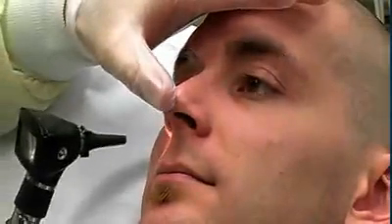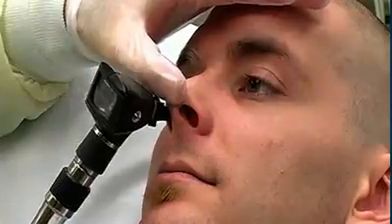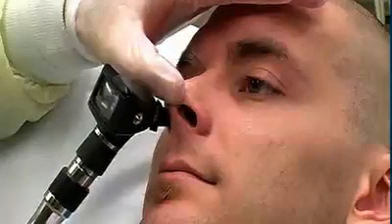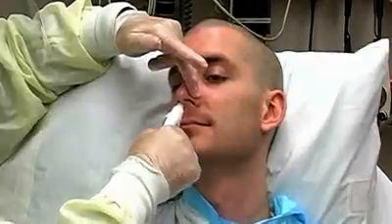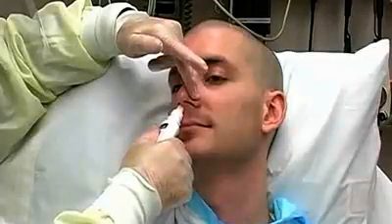Look in the nasal passages with an otoscope to identify septal deviation or other impediments to tube insertion. Use these observations to choose the appropriate side for tube insertion. Next, apply a topical vasoconstrictor such as oxymetazoline or phenylephrine to shrink the nasal mucosa. This opens the nasal passage, which reduces risk of bleeding and makes tube insertion easier.